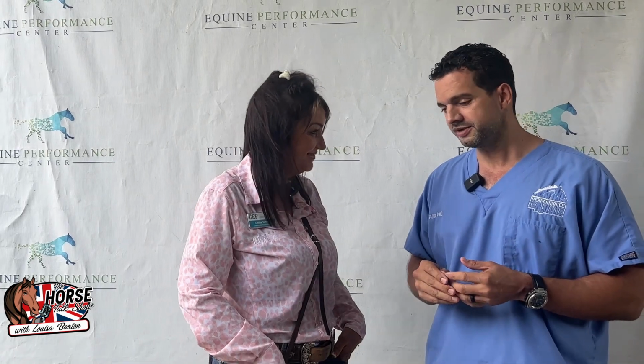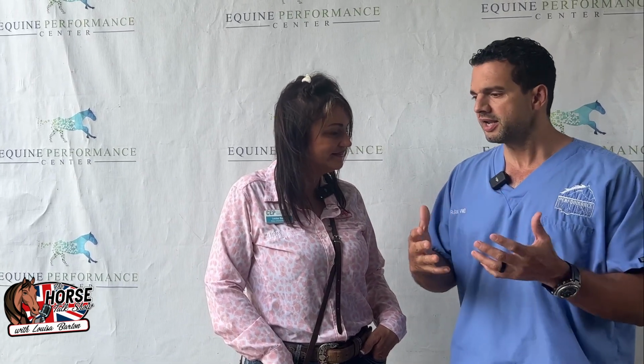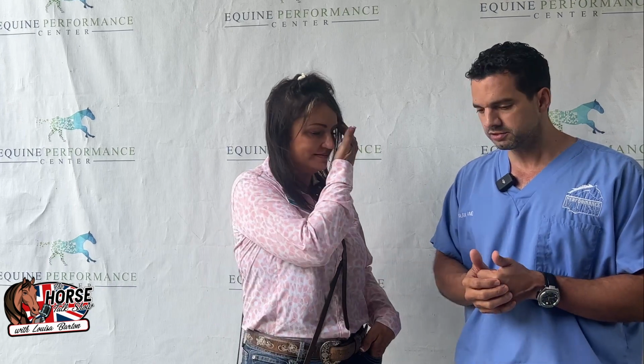Then we have shock wave, which is sound wave, right? It's literally what it is. It's a sound wave that penetrates the tissue, increases circulation, increases growth factors, and helps with pain, absolutely, and with healing in general. Wow.